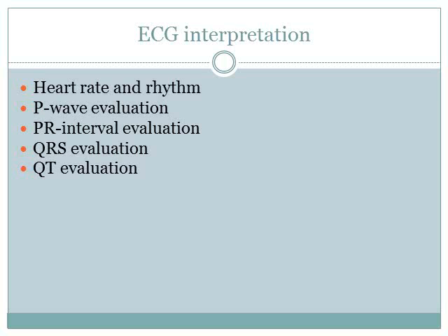So this is all related, but just for the purpose of putting it into points, I have them laid down like this. So the P wave evaluation, we kind of talked about this before also. We'll talk about it in a minute. P wave evaluation, PR interval evaluation, we somewhat talked about it before. QRS evaluation and QT evaluation.